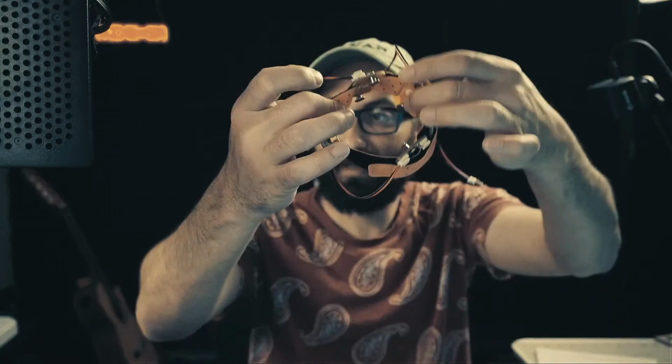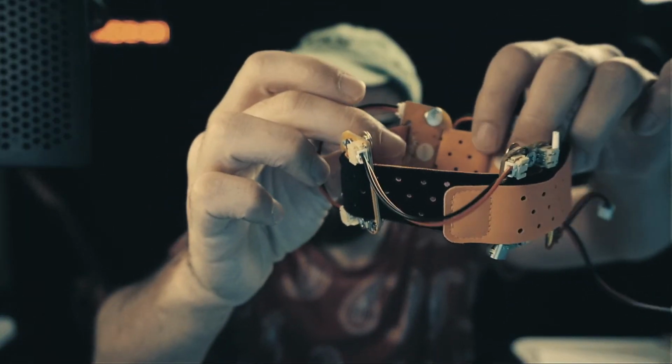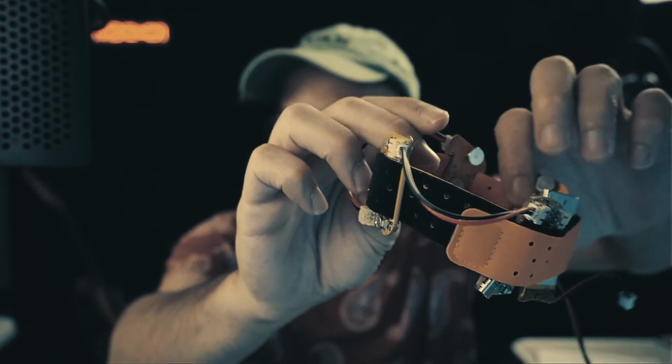But if I find his comment where he said where to solder the board, I can zoom in using my microscope and show that next time. But I do not want to mess with these boards. I'm going to leave them as is because I'm afraid I would break them. It's honestly a great product, and I love that the electrodes are inboard. Yeah, it's super cool. Again, wonderfully made, super easy to use.